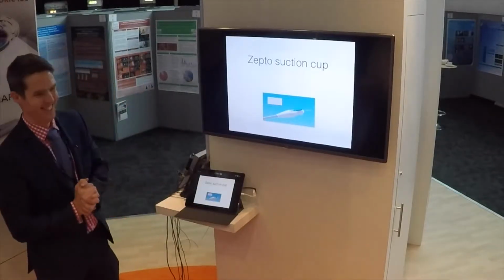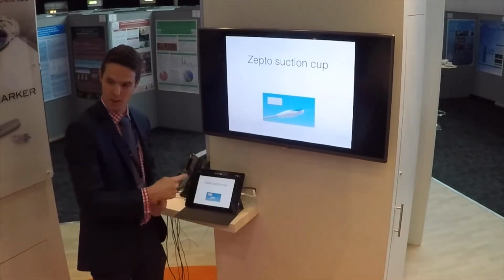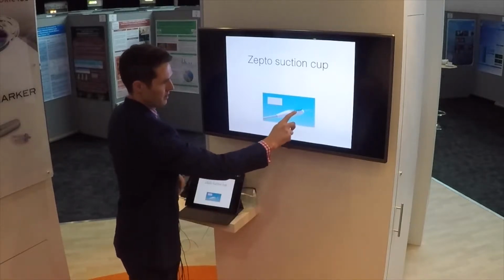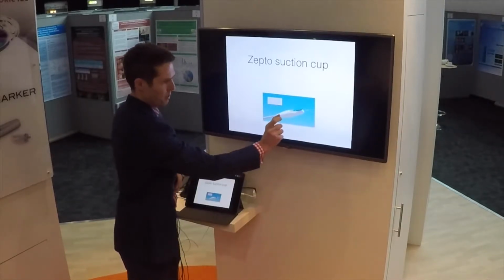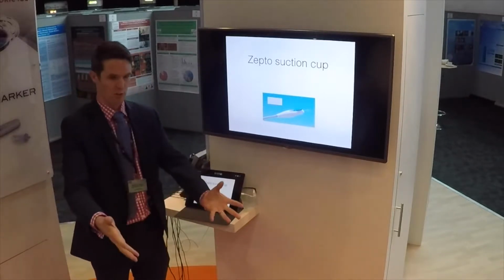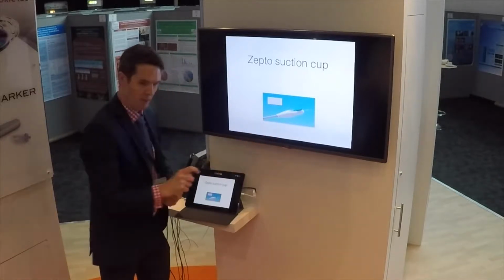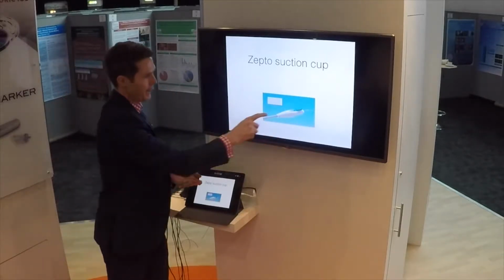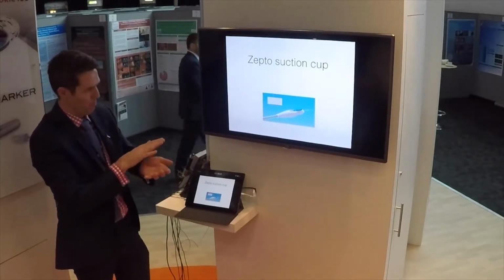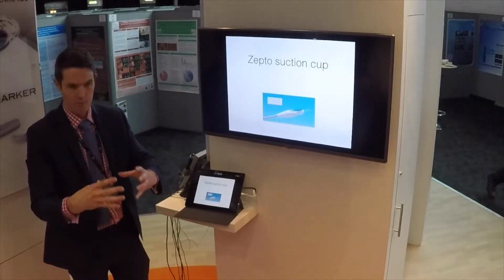There we go. There's the handpiece. This is a disposable handpiece, so you pay per surgery. This is the business end. This is the handpiece for you to hold, and then the distal end connects into the unit which your assistant plugs in. This retracts. This button here is the only bit that you need to move. It retracts the nickel titanium alloy and then pushes it forward when you want to open up the circle to apply it to the anterior capsule.